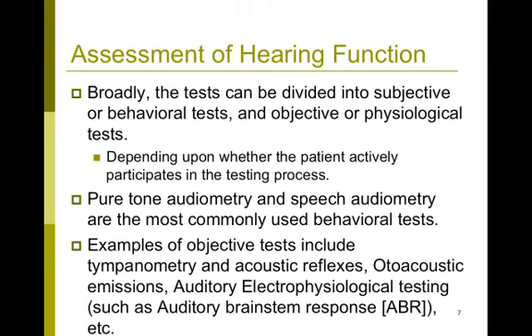But we also have other tests such as tympanometry, acoustic reflexes, otoacoustic emissions, and auditory brainstem response testing, where the participation of the patient is minimal. So we need their cooperation, but they do not need to actively respond to sounds. And these are considered objective ways of testing, and they are testing different physiological measures.